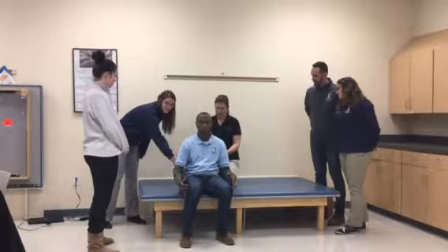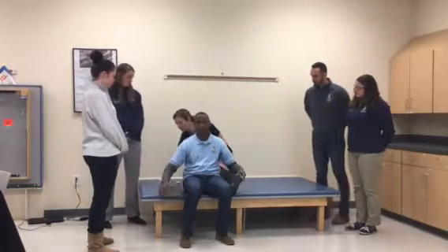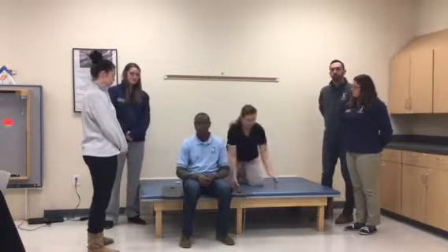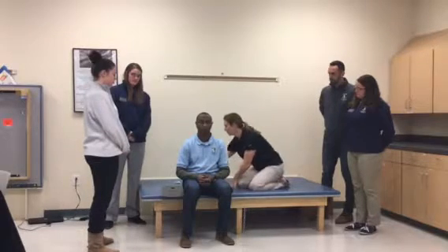It's 15 inches. Okay, great. So from those 15 inches, we take that and add 1 inch, and that will allow us to have a 16-inch wheelchair measurement for the width.